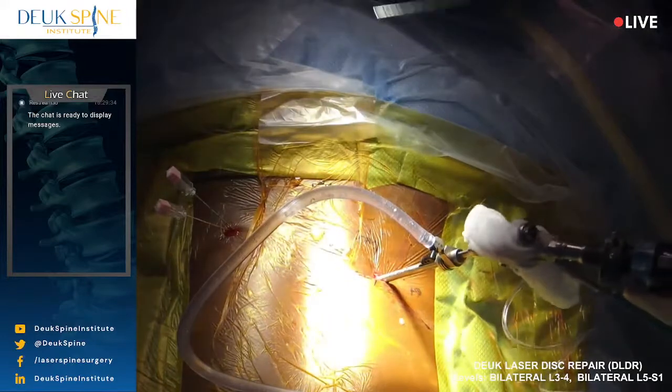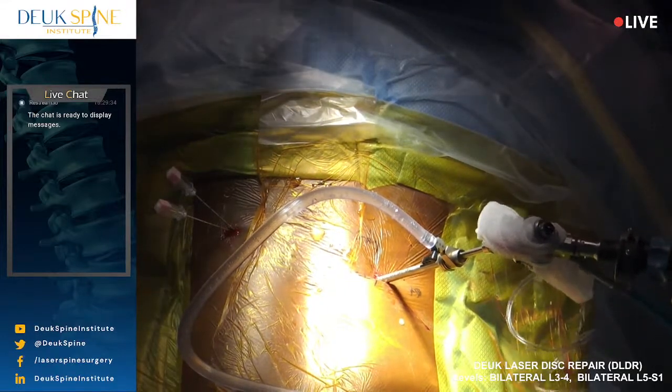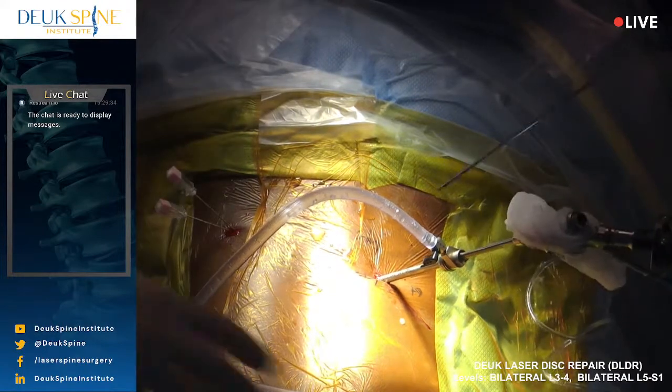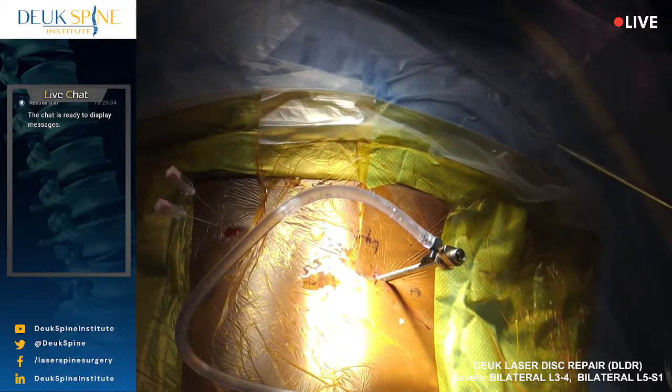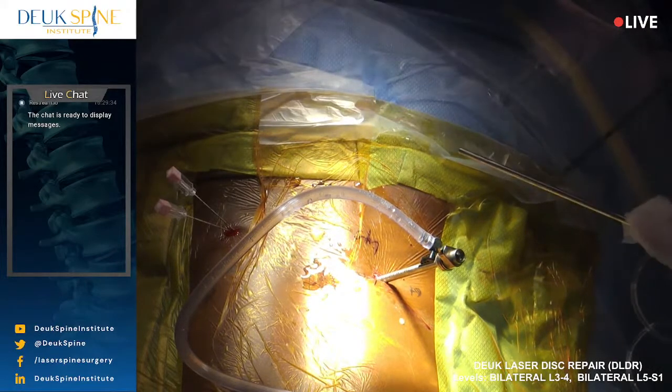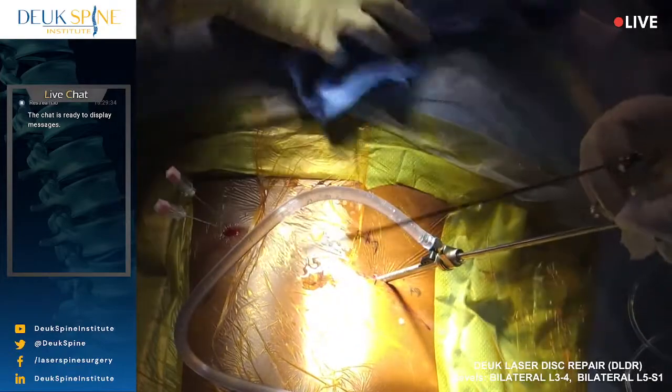Scope on, guys. I need my scope on. Hello? No, the scope, this scope is... Listen, turn on the machine, yes, and then stand by. Thank you. I need that to show the scope up there. Oh my.